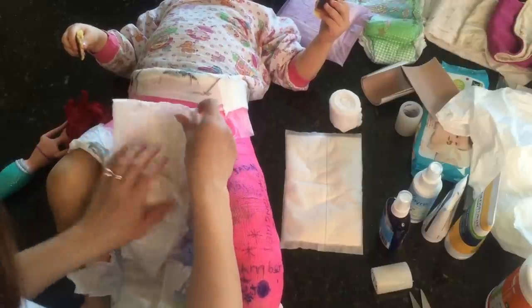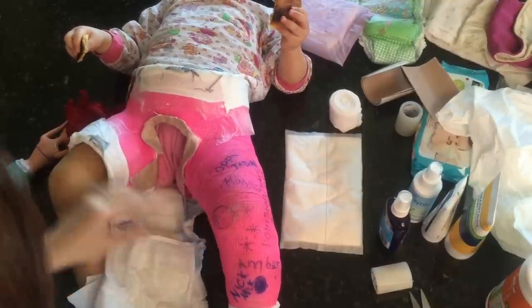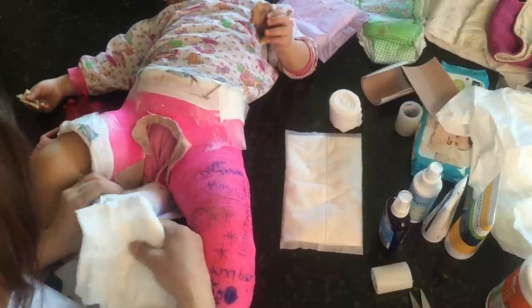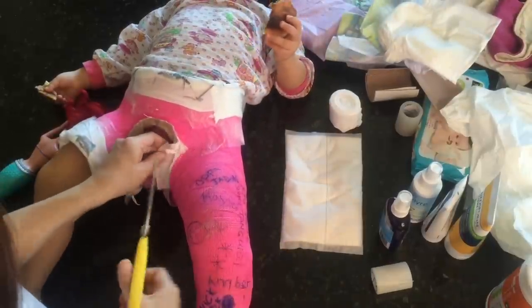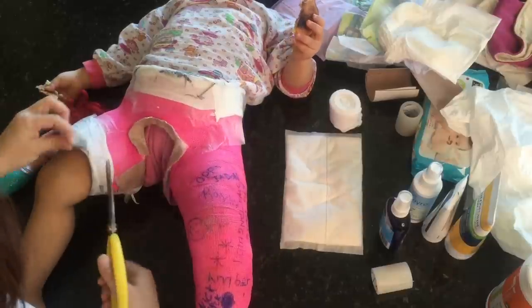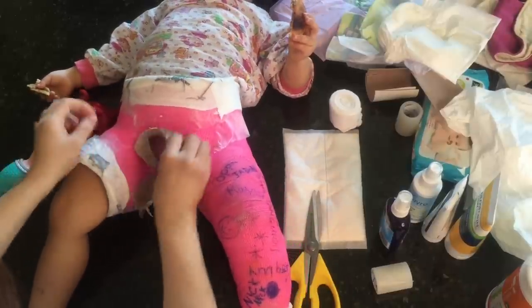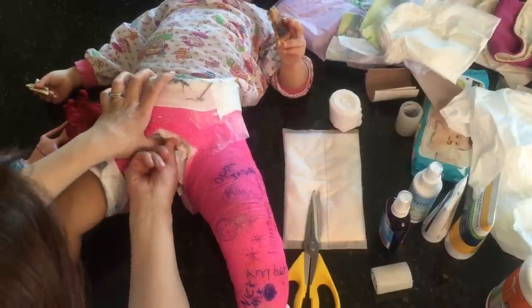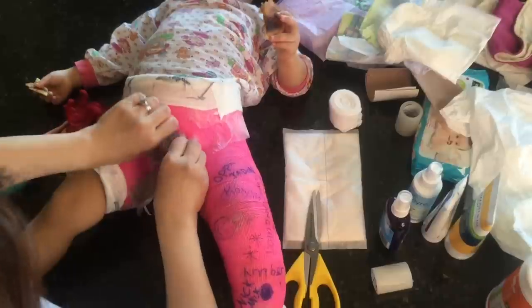I couldn't go on with that for another six weeks — this is her fifth week. So I'm going to share what I did. I got scissors and cut the gore-tex around the opening, exposed the inside, and noticed it was all yellow, gooey, and wet — really disgusting. I pulled a lot of the sponge out and just trashed it.